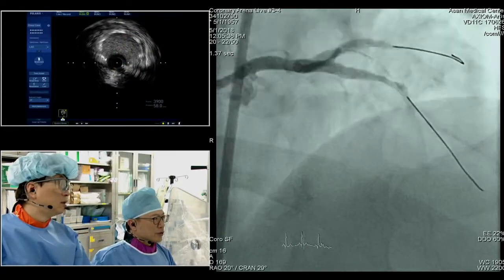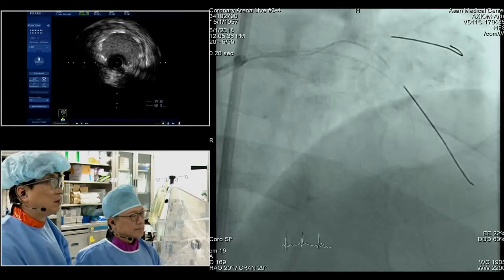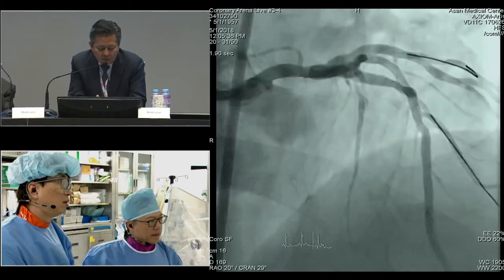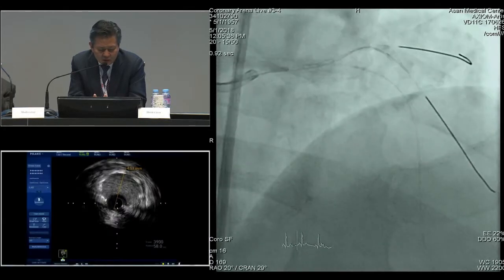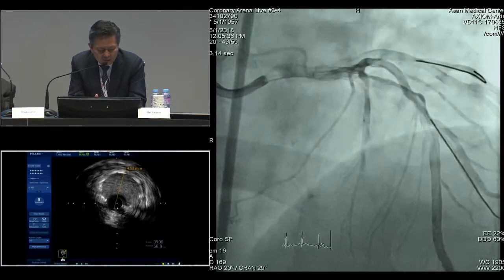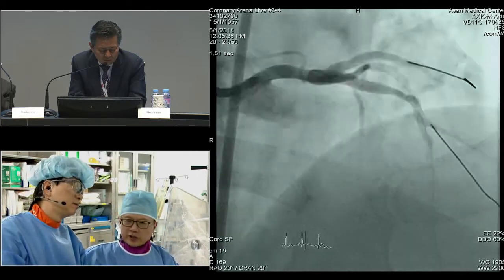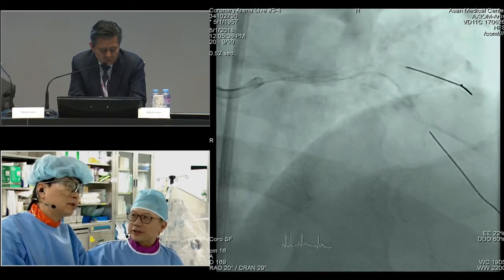So, panel, should we fix the distal LAD? On angiography, and from what I've studied, maybe it is not necessary to do another procedure on the distal stent, but if you have time, would you like to show us the result of the FFR study? Okay, we'll see whether we have time and can change over to FFR. Before that, we should probably post-dilate. But I heard a comment about rewiring the circumflex, opening it up, and doing kissing. We don't do that here in Asan.